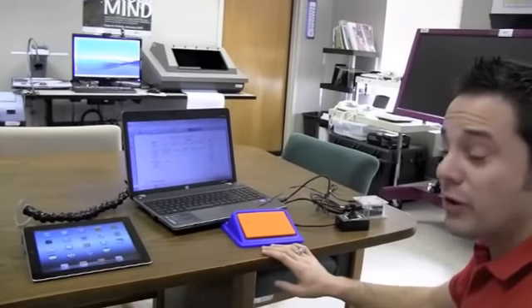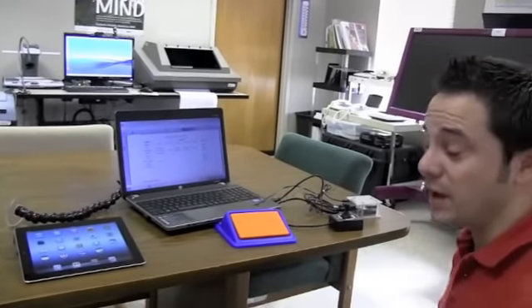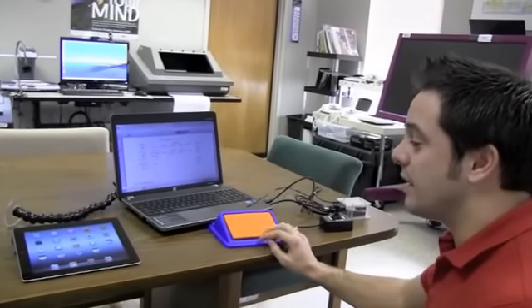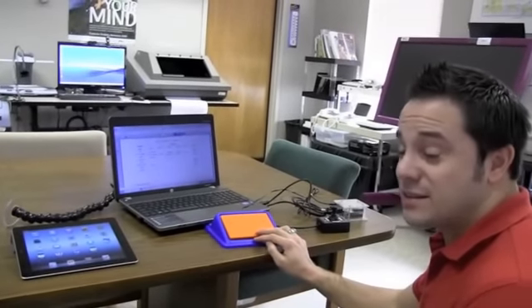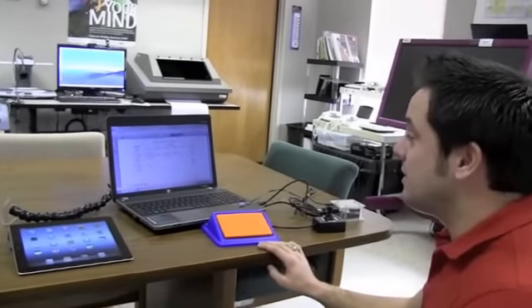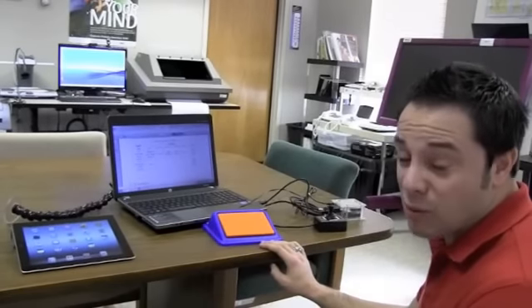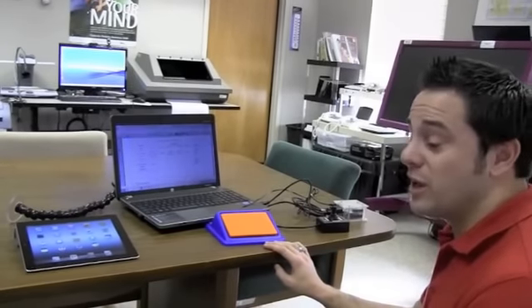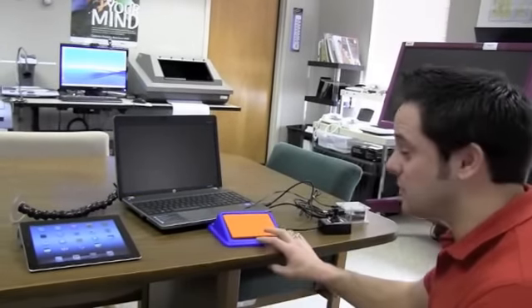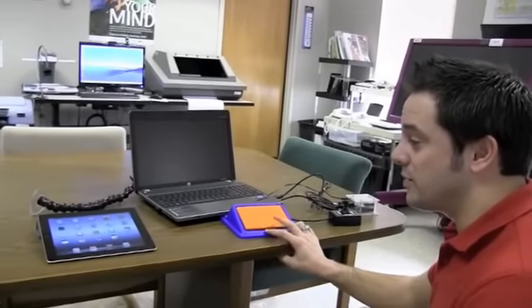If you hold it for a certain amount of seconds, that's going to give a different command. Holding it for one second allows me to select something, and two seconds allows me to toggle the keyboard on. You can scan through the keyboard just like we did with the applications by tapping the switch once.